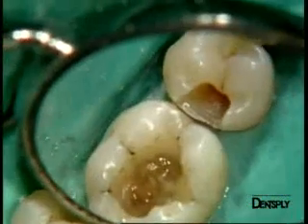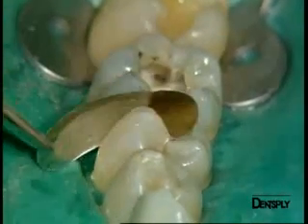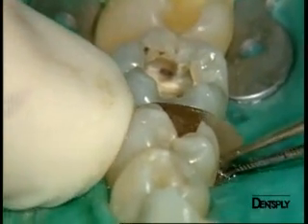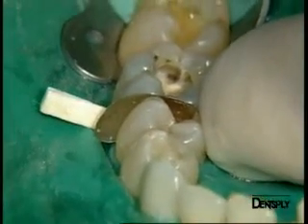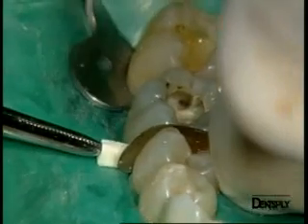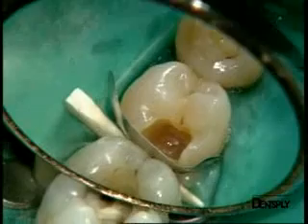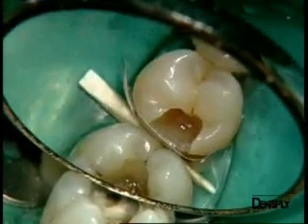The cavity preparations are now fully completed, and we insert a palodent sectional matrix for the proximal filling of the premolar. It is easily inserted using tweezers and kept in place with a finger. The wooden wedge is forced in to hold the matrix in place at the cervical margin. This matrix is held with a finger to avoid displacement when the wooden wedge is pushed in. The wedge must be placed with a certain amount of force to achieve good sealing. We will later add the rings to improve its adaptation.